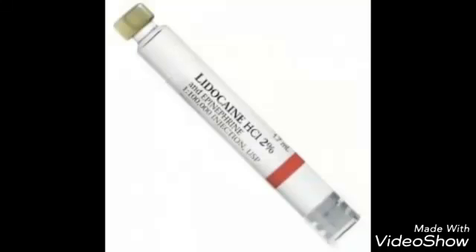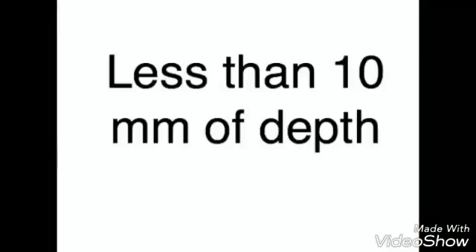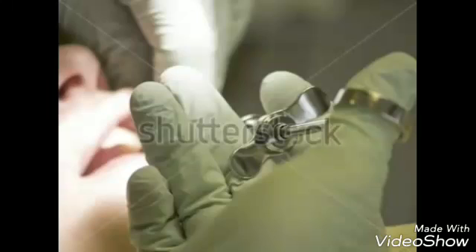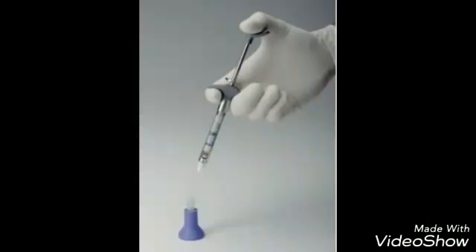Place the bevel gently against the blanched tissue. Apply enough pressure on the syringe to slightly bow the needle. Deposit a small amount of solution, then straighten the needle and gently insert into the mucosa. Slowly advance the needle until it gently contacts osseous tissue, then withdraw slightly. Depth of insertion is less than 10 millimeters. Aspirate; if negative, slowly deposit approximately 0.45 to 0.6 milliliters over a minimum of 30 seconds. Withdraw the syringe, recap the needle, and wait two to three minutes before commencing work.